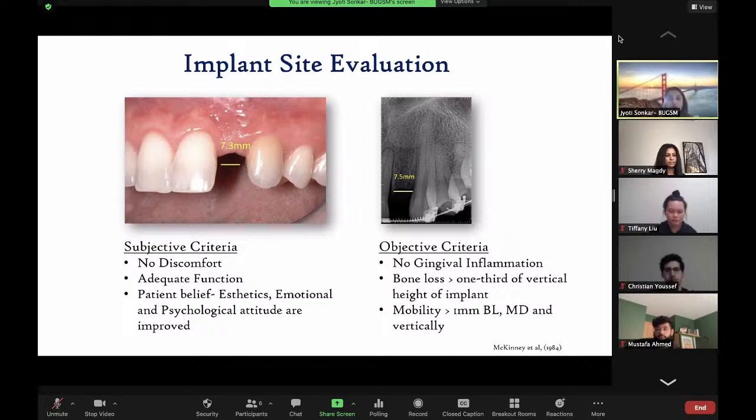At the same time, the technical criteria are fulfilled, meaning when you replace an open space with dental implants, a dental implant shouldn't cause more damage to the gums, shouldn't cause inflammation, shouldn't trap food around it and cause the bone to be lost or cause the gums to be angry and red. It shouldn't cause bone loss in adjacent areas. It should just be in harmony and adapt to the existing teeth. So you want to make sure that when you're replacing an open site, all of these criteria are satisfied. And if they are, then that's the next step that you want to move forward to. I hope I made some sense.